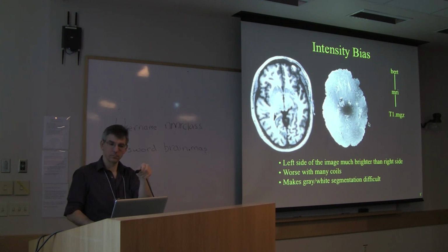I would also follow up with the coil question, that there are 8-channel coils that are really, really hard to analyze because they don't have coverage near the vertex. So you get this whole region at the top of the head where you have very little signal. And so the larger N arrays are typically better for that kind of thing. So it really depends on coil geometry. It's not just coil count. You know, like the 32 channels are really good. The 12-channel Siemens is actually pretty good as well. The 8-channel arrays are usually awful, except if you happen to have a better distribution of coils.